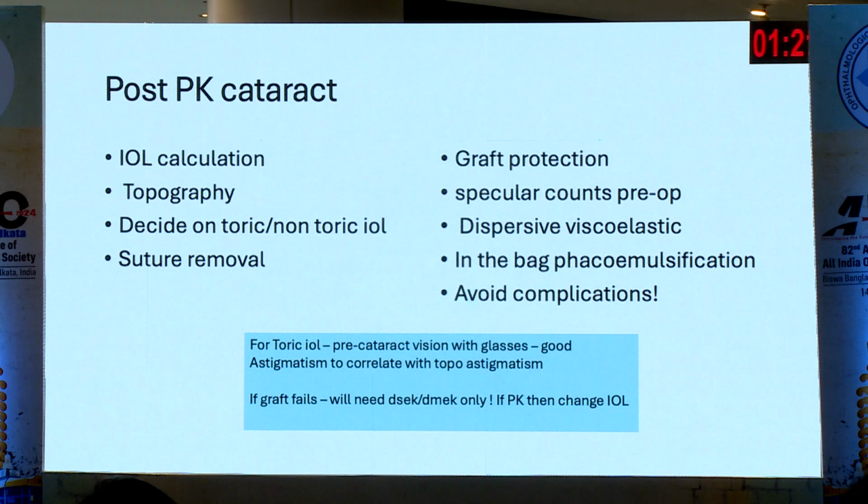You would take all measures to protect the graft, which would be a dispersive viscoelastic, obviously an in-the-bag phacoemulsification, and you would want to avoid a PCR at all costs. You don't want to increase the time that you're spending in the anterior chamber.